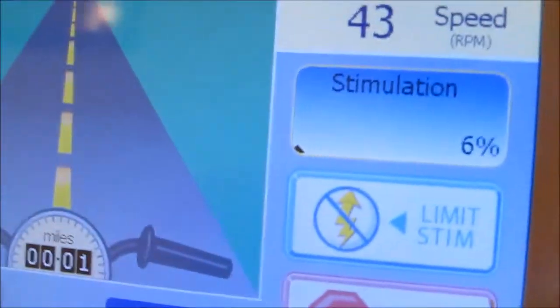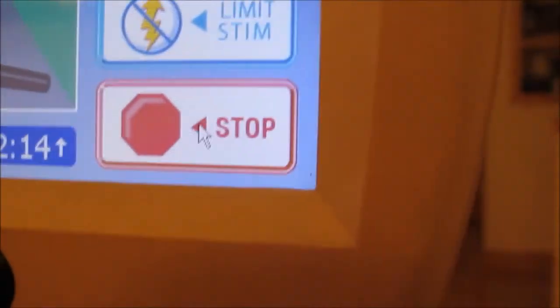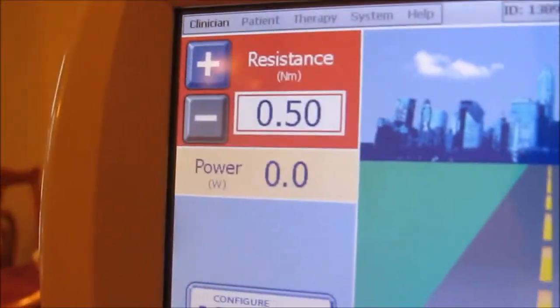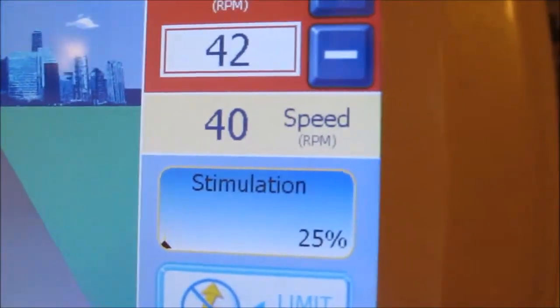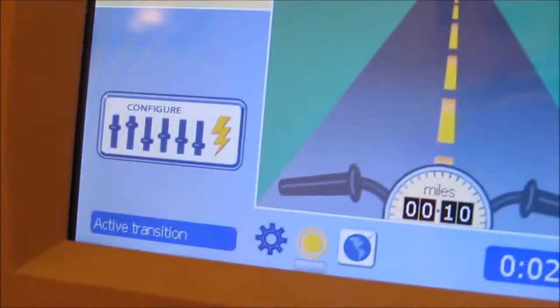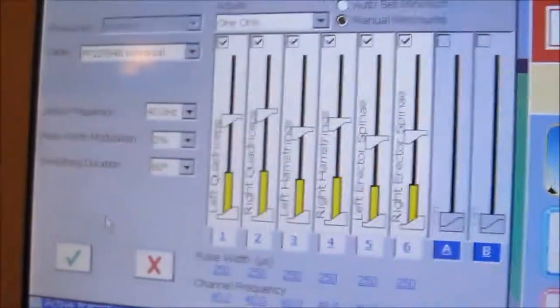I'm at the active transition now, so stimulation is slowly ramping up. If it was way too strong for me, I would press the limit stimulation button, or I would hit the stop button. I can also increase my resistance as my muscles get stronger, and I can also add the RPMs to make myself go faster. If I ever want to change anything, I go to configure, and that shows my muscle groups and how much stimulation they're at.